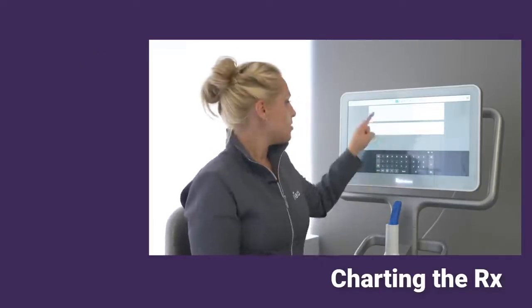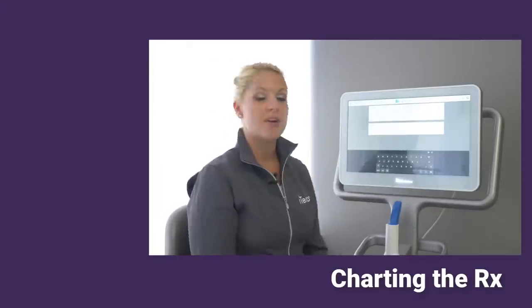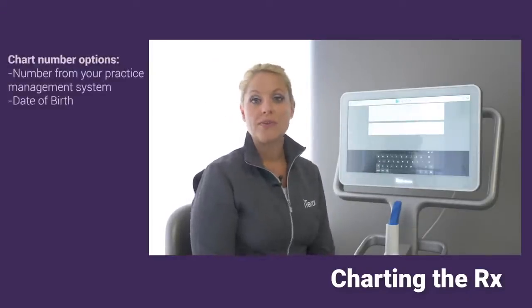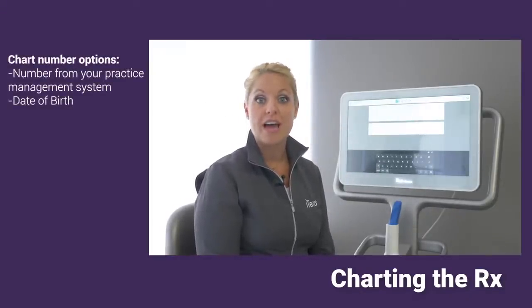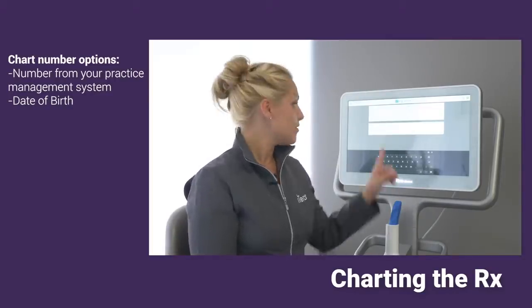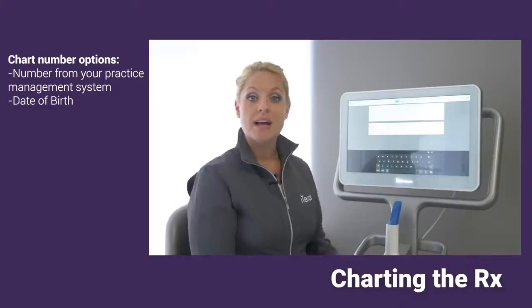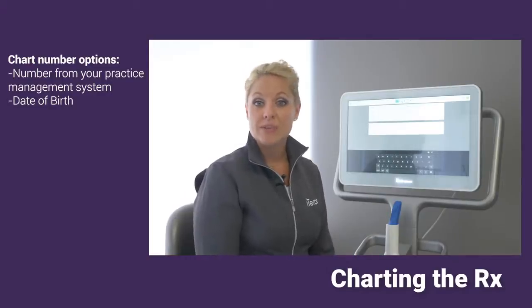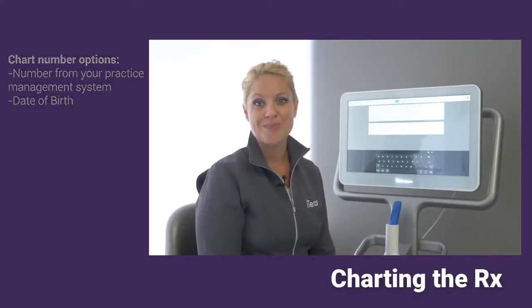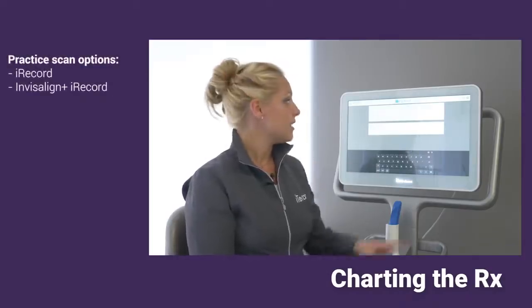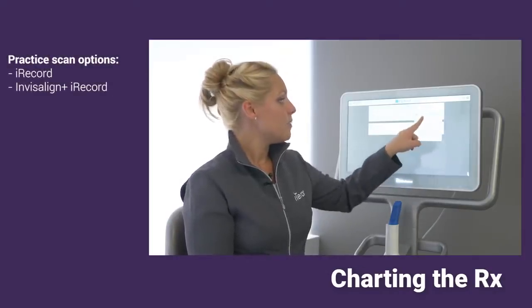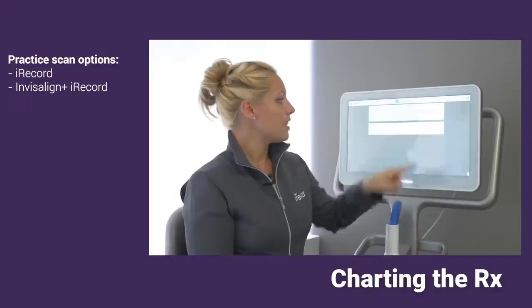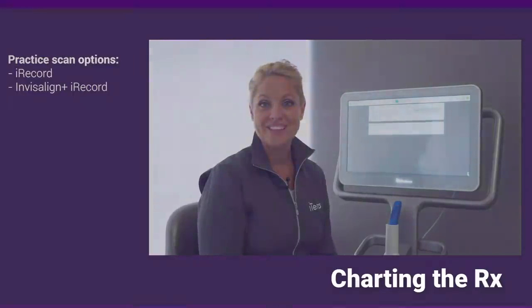Now underneath there, we have the option for your chart number. If you're using a practice management software that identifies your patient through a specific number, please provide that here in the chart number. If you are not using chart numbers, you do have the option of putting in the patient's birth date as well. Now for practice scanning, in your case types, you may want to use iRecord or Invisalign Plus iRecord for today.